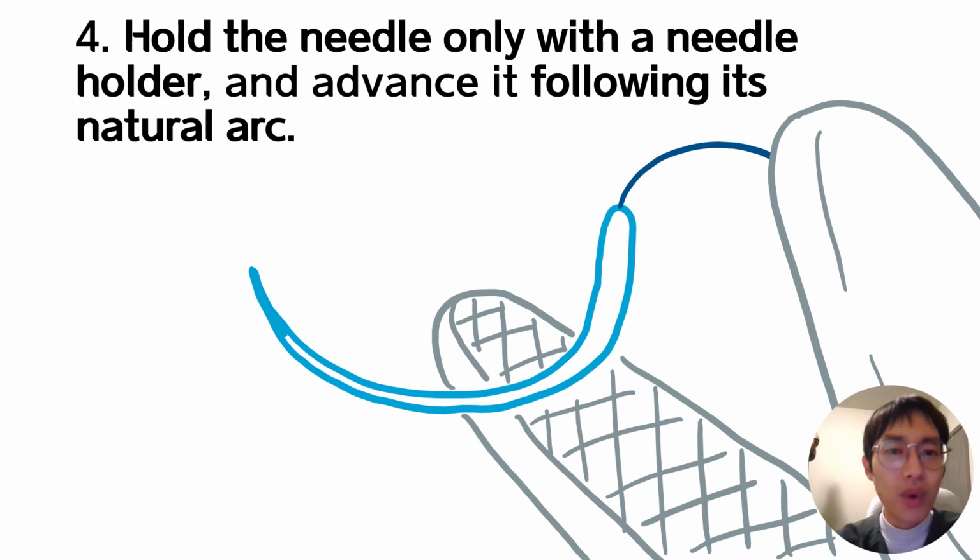So number 4, hold the needle with a needle holder. I have also tried to use the pincette or the cotton plier to manipulate the needle, but it is very challenging. It is like, why do you suffer?